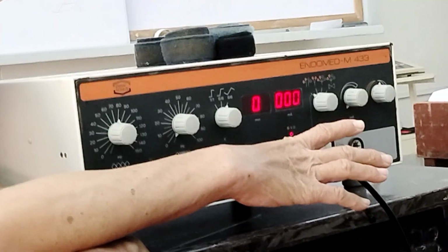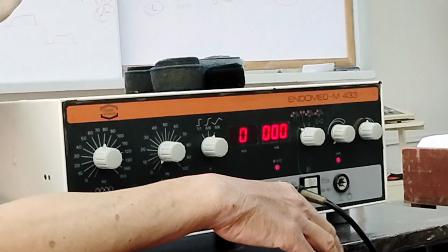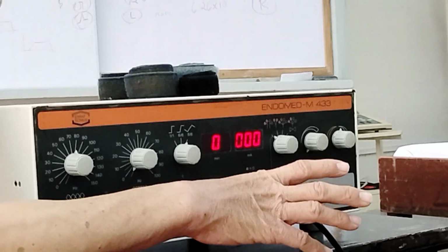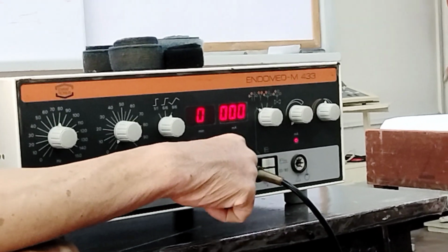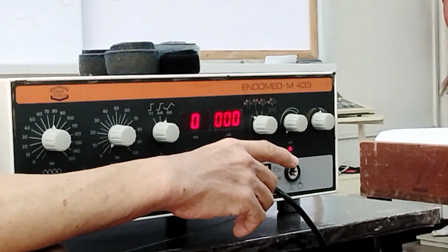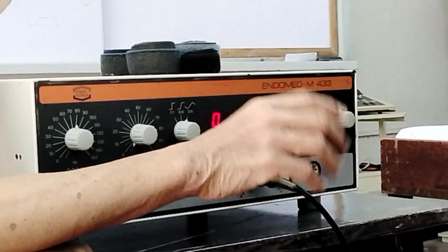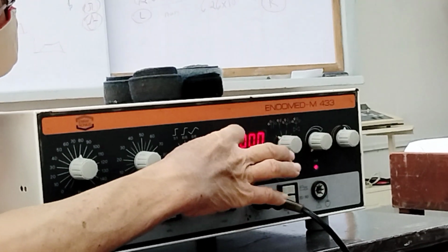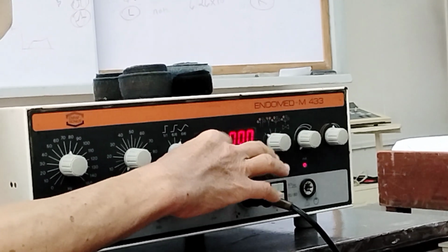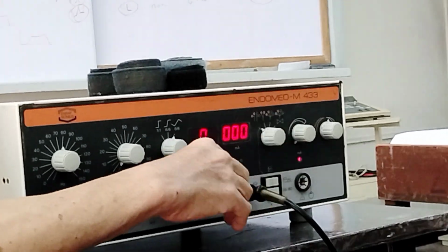For muscle stimulation or contraction, you can have 10 to 15 minutes, or probably based on the number of contractions you want. It's up to you. Kung ganyan kag 20 contractions for that session, just have it count for 20 contractions, just take note of the time, kung hapit na siya, kung siya kaabot ng 20, so increase, ano siya?